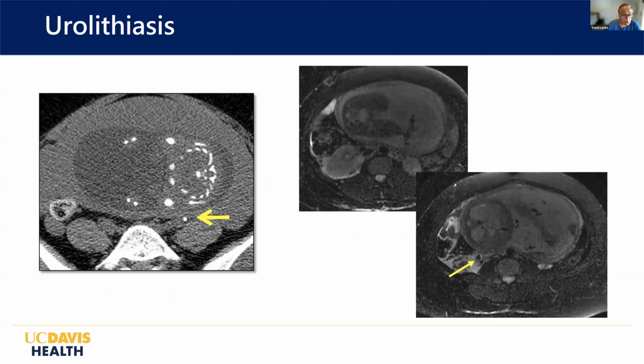Oh, beautiful. Thank you. So another example over here of urolithiasis, a stone in the mid-ureter in the pregnant patient, is the example on your left. The example on your right is perinephric edema seen in the T2-weighted images and filling defects seen in the distal ureter. So that is a positive example of urolithiasis with MRU.